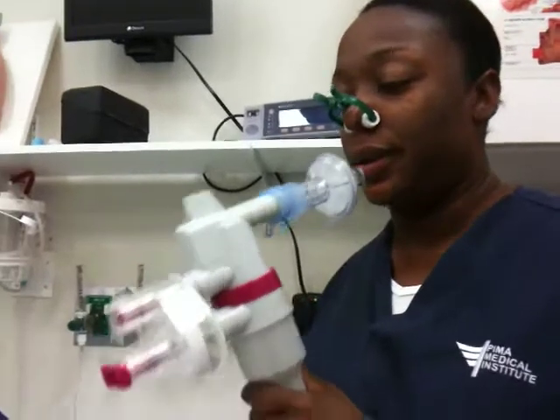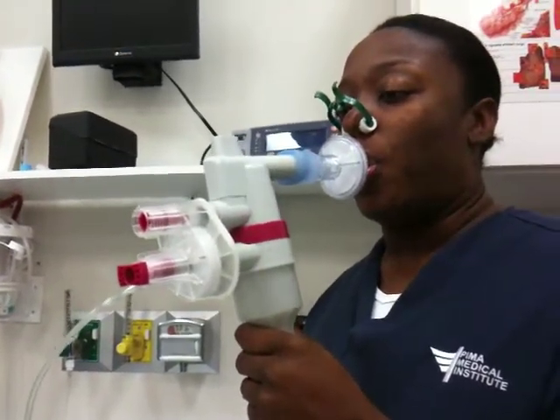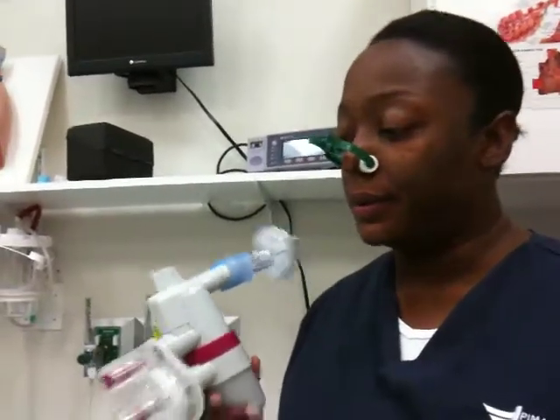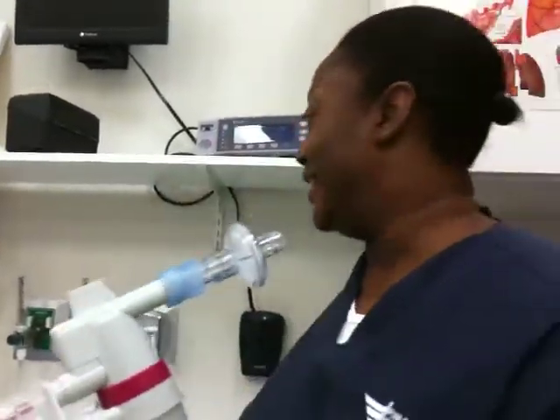Nope. Try it. Probably a little bit of resistance there. Is it harder when you exhale? No. When you inhale, you exhale — you're going to inhale the pressure. And it's very hard to control your cheeks. And you get lightheaded. This is enough.